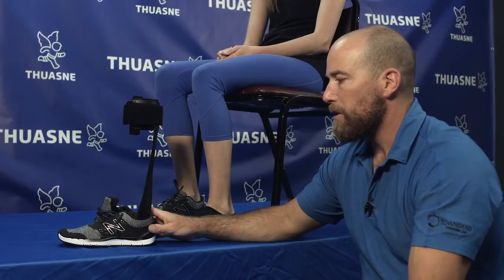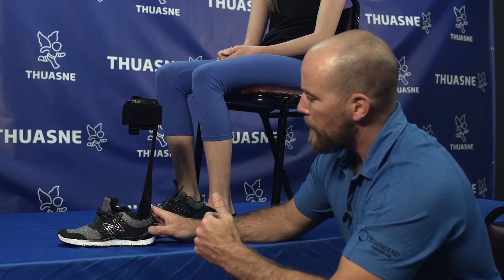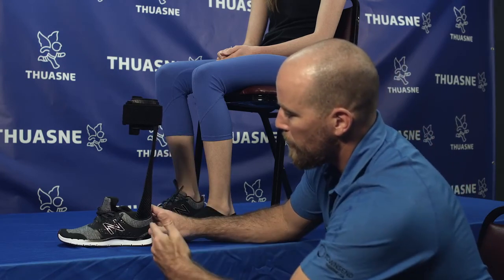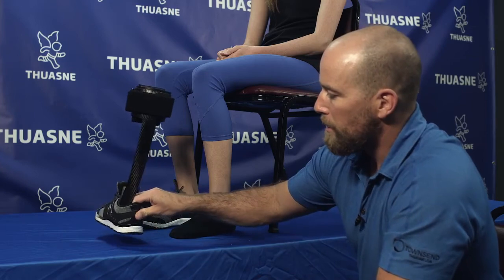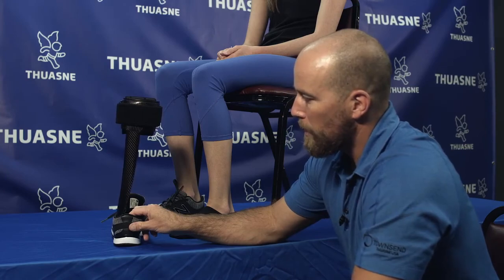Prior to fitting your patient, you want to make sure that the strut is perpendicular in the sagittal plane. So you want to take a look and make sure it is positioned properly within the shoe. And then you also want to check in the coronal plane to make sure that the strut is perpendicular as well.